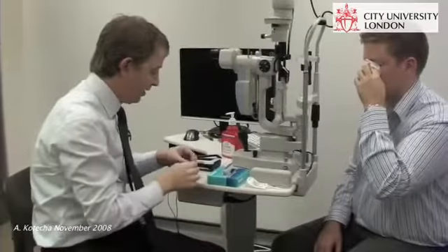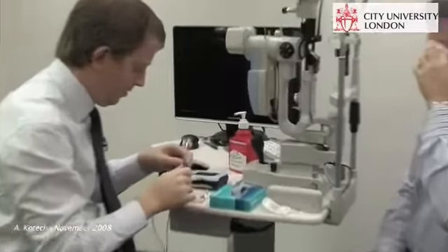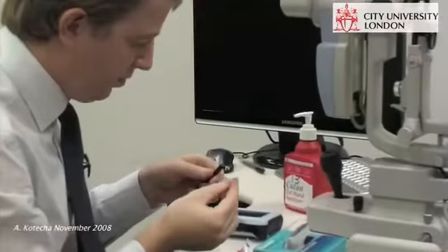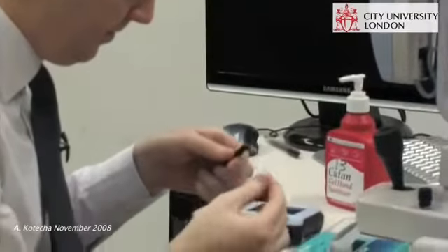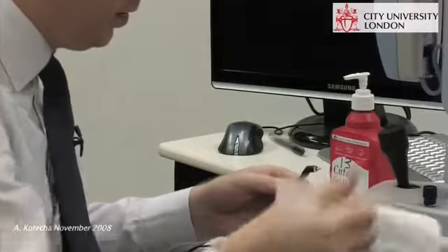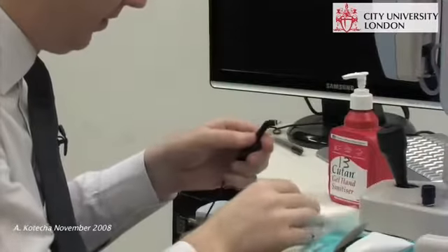Well done. And I'm going to clean the pachymeter tip using an alcohol swab. Normally I'd let it air dry, but I'm going to use a tissue to make it a little faster.